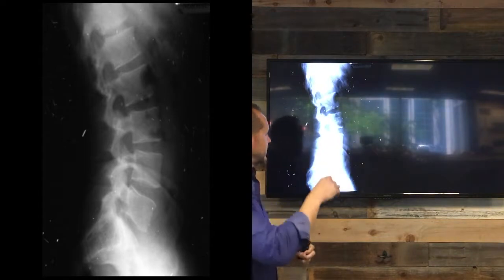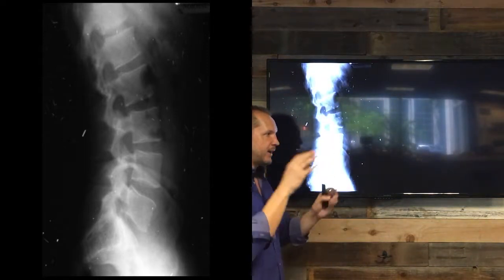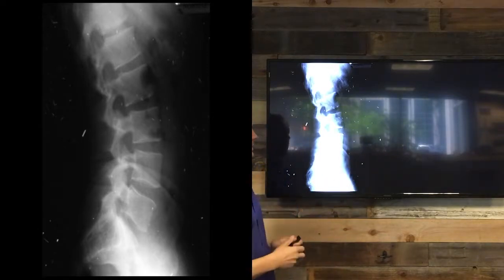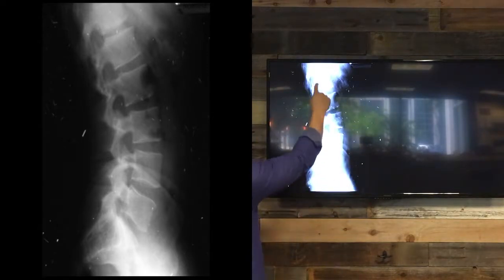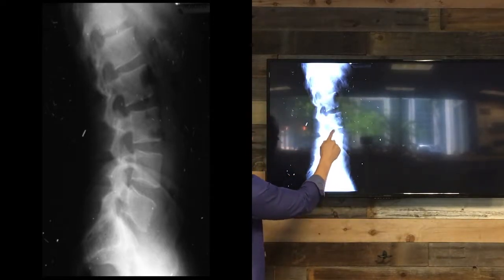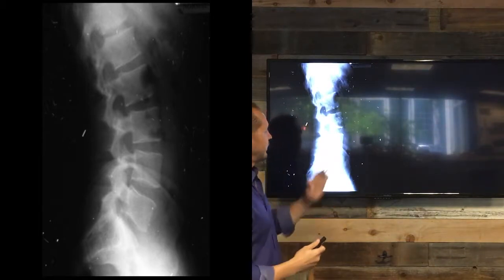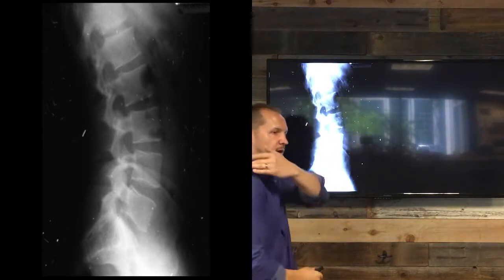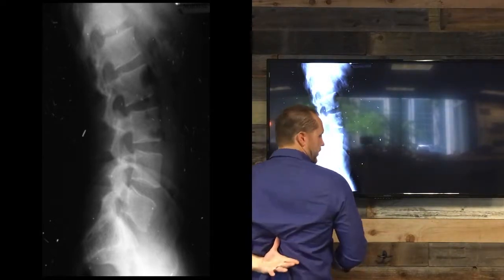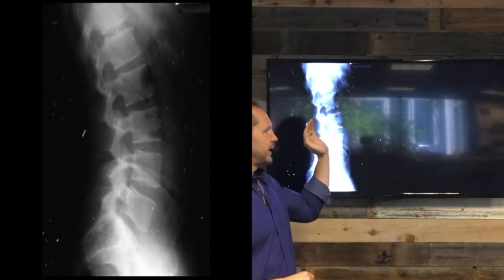So moving forward, this is a healthy lower back from the side, where, again, kind of like the neck, this person is still facing this direction. A couple things you'll see that are similar to the neck. If you notice this curve again, almost like a banana, and then we've got the disc spacing and we've got the smooth bone. So very similar to the neck. The only thing from the side view that would look different would be your mid-back, kind of from your shoulders to roughly about down here just below the shoulder blades. That's the thoracic spine. That would be bending the opposite way.